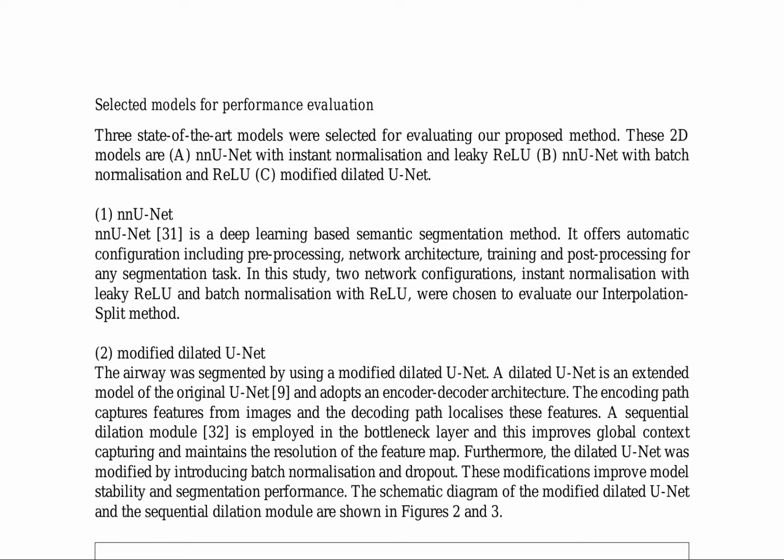3 state-of-the-art 2D models were selected to evaluate the proposed interpolation split method: nnU-Net with instance normalization and leaky ReLU, nnU-Net with batch normalization and ReLU, and a modified dilated U-Net.